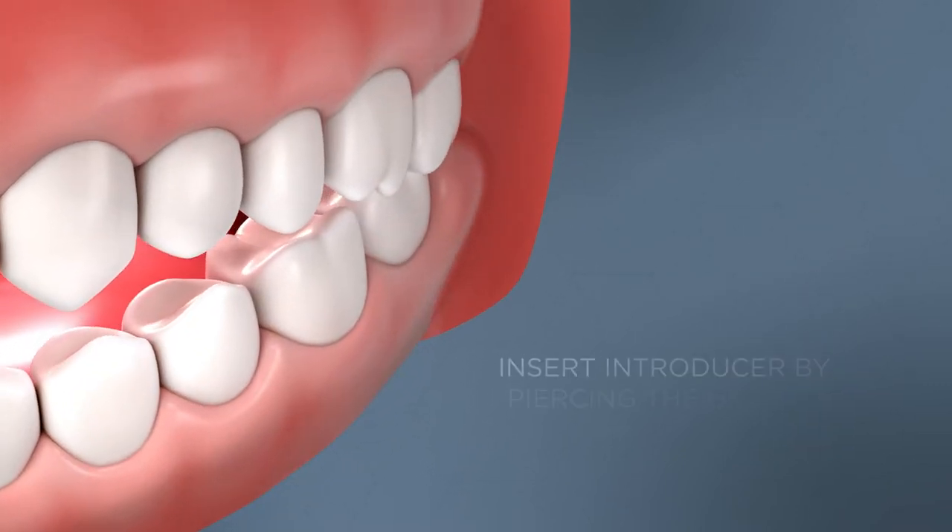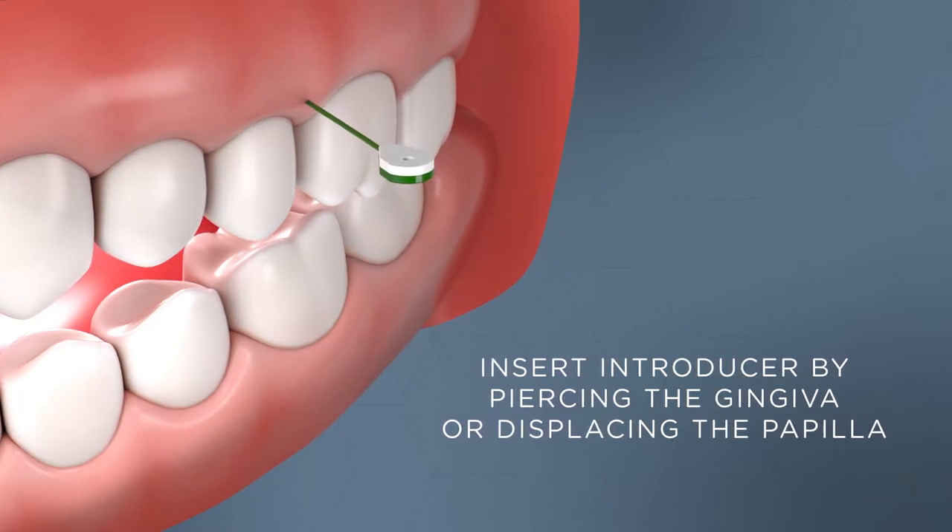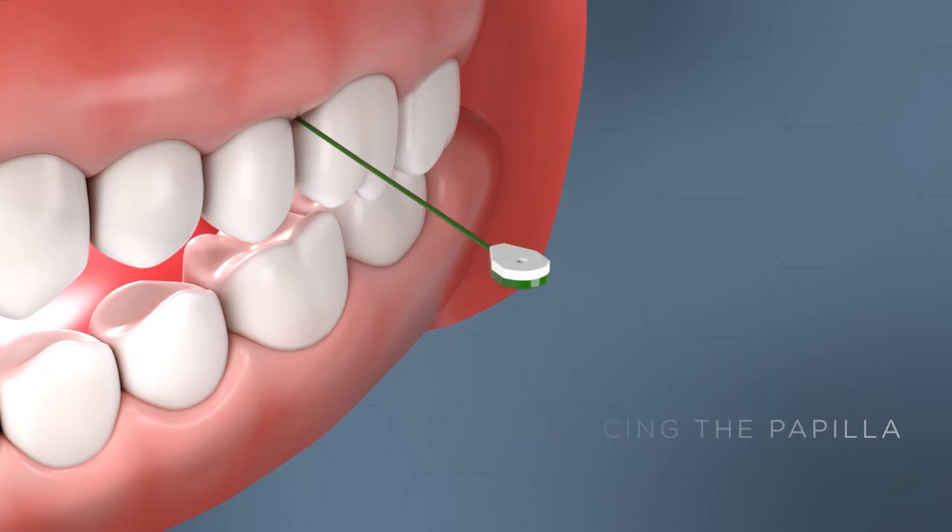Begin the application of mini ties by inserting the blunt tip stainless steel introducer into the embrasure by either piercing the gingiva or displacing the papilla.